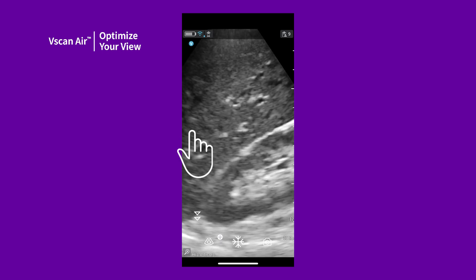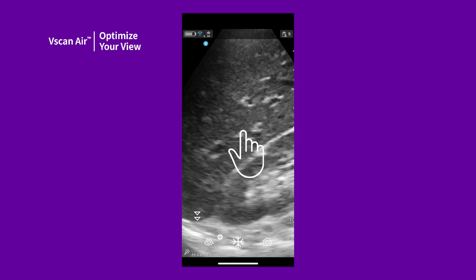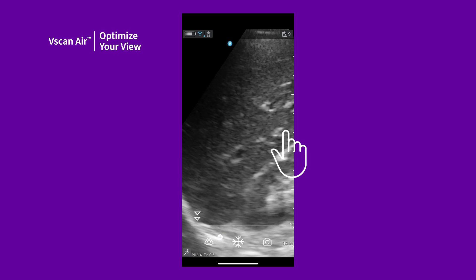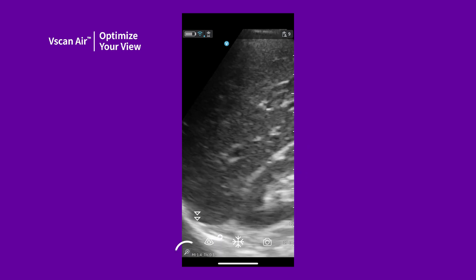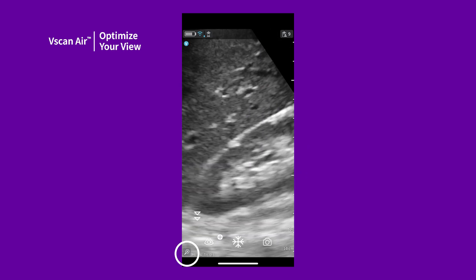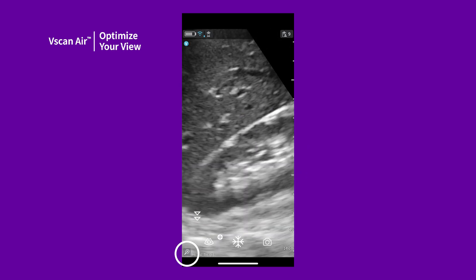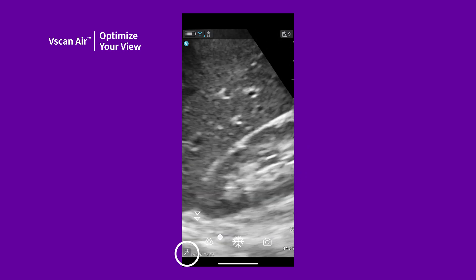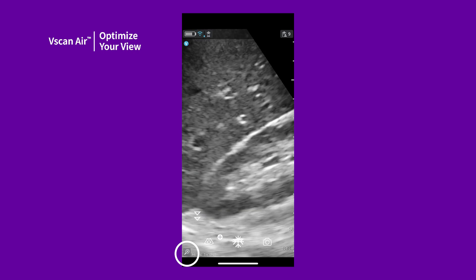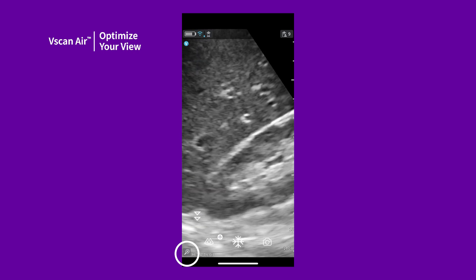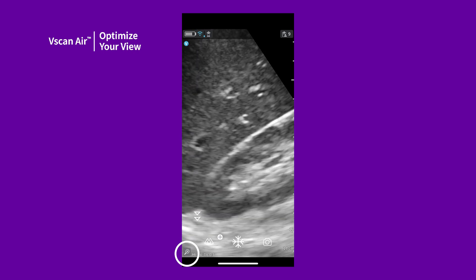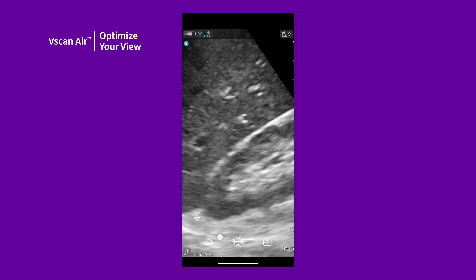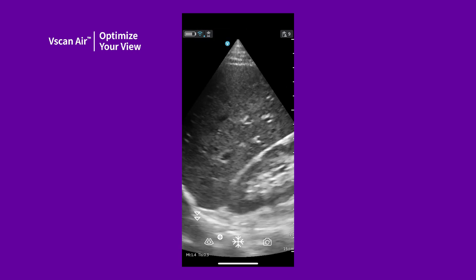Pan or move a specific area of the image by sliding your finger. A zoom indicator is visible on the screen to indicate a zoomed-in image. You can also tap this to return to unzoomed live B mode.